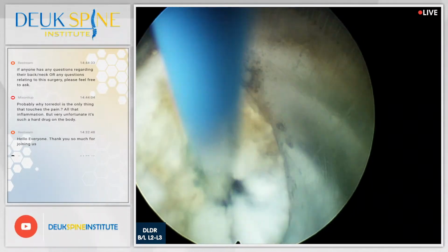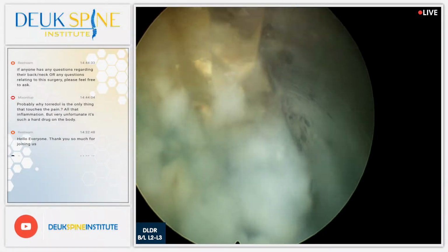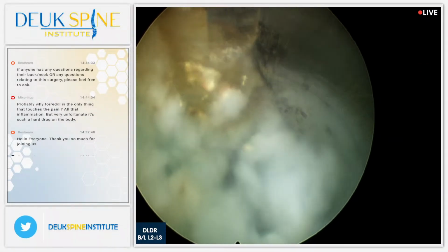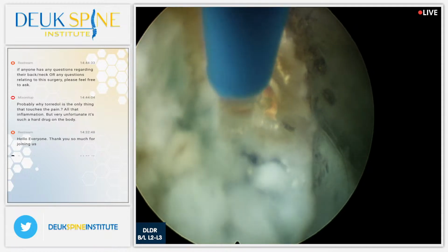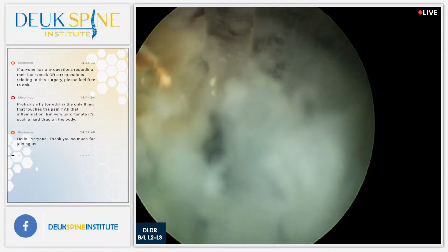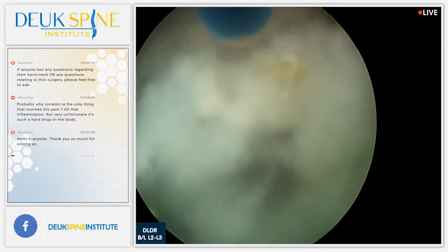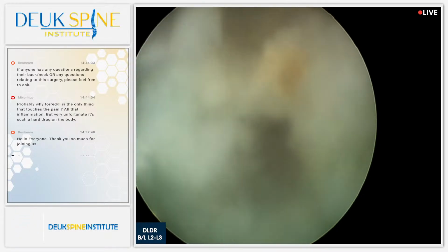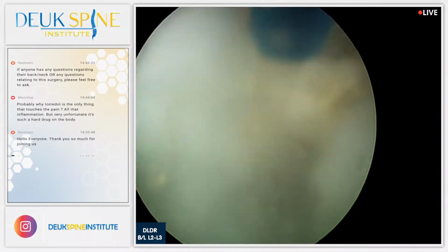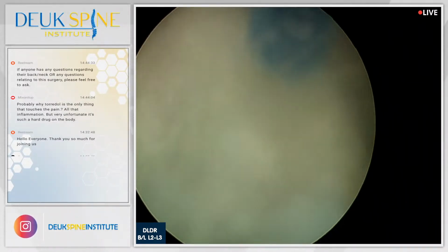I learned that lesson the hard way about 18 years ago when I didn't realize that I needed to do that, and I left a piece of herniation in. Patient came back with pain and symptoms, and I took an MRI and saw that there was still a big piece of herniation that I never got that was causing the problem, and it's because I didn't go lateral.